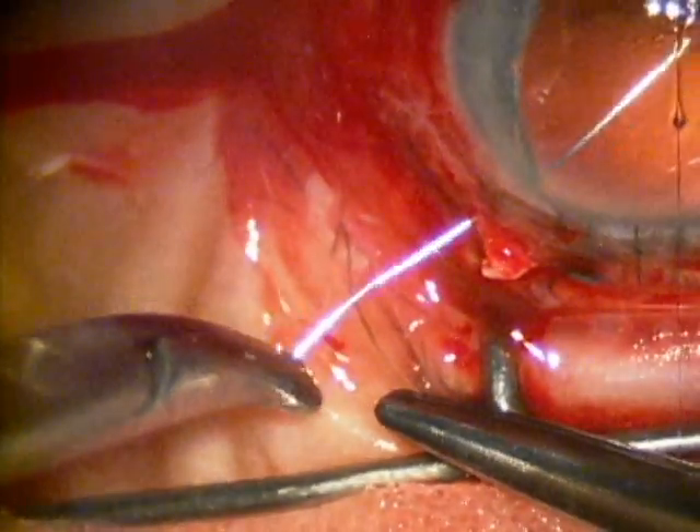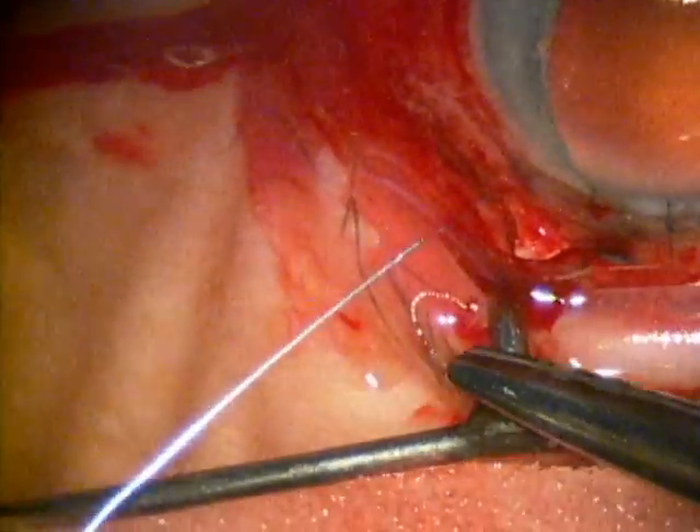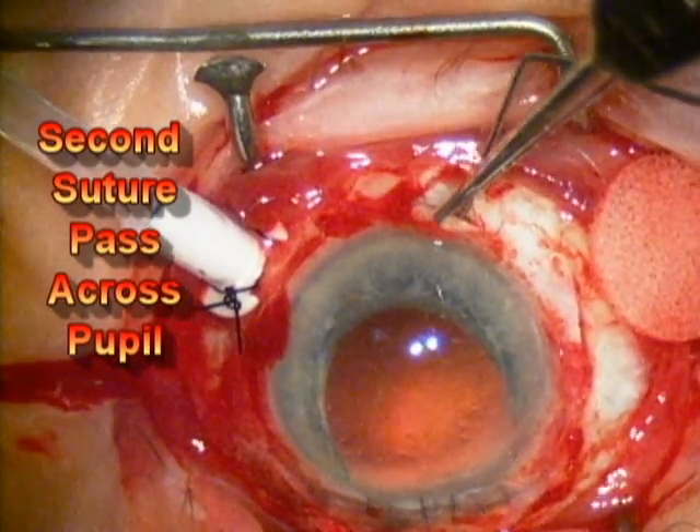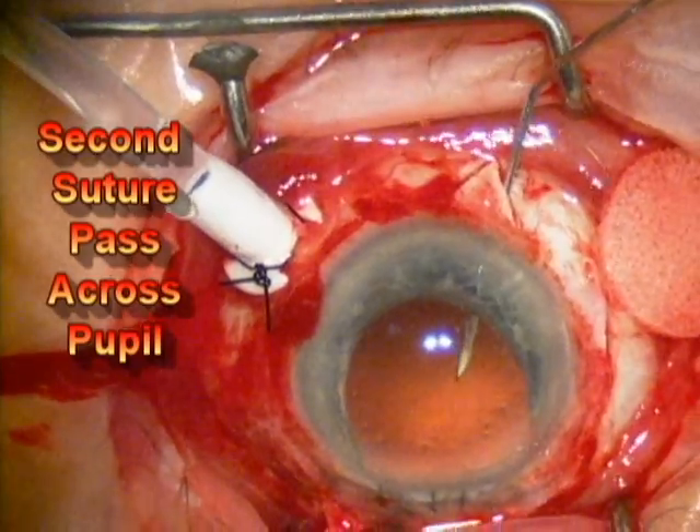These needles are all placed underneath the scleral flap. You'll notice that that one was placed toward the left side of the flap and this next needle pass is done on the opposite side of the scleral flap.